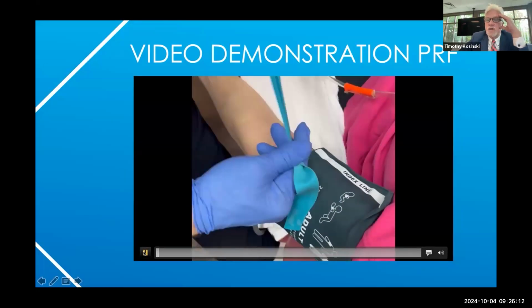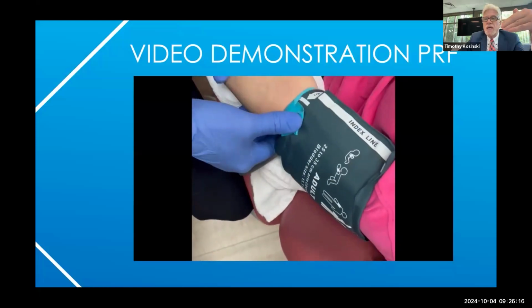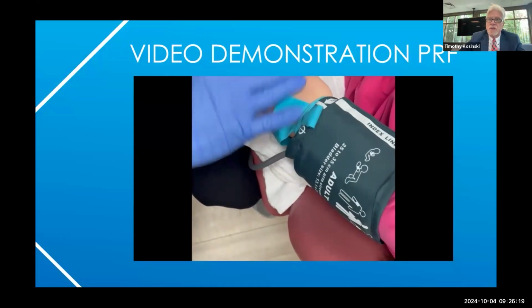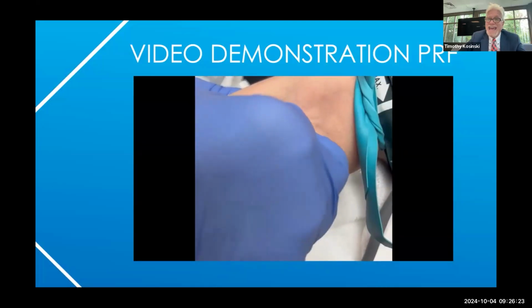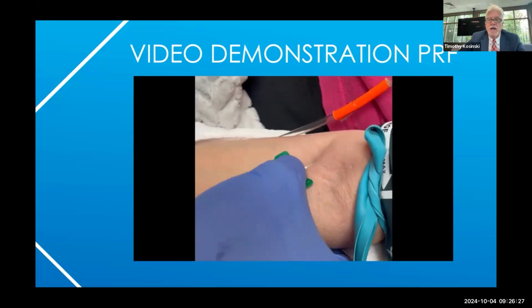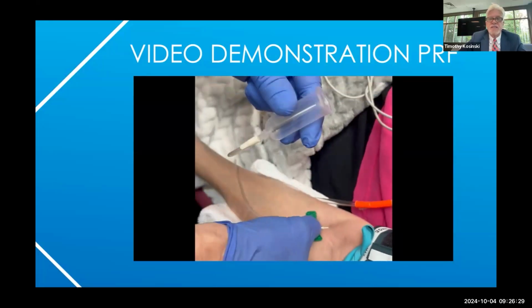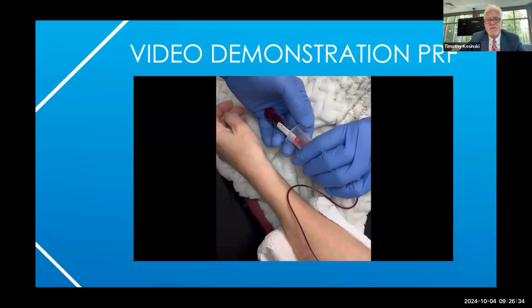So what we do is we tourniquet the patient and we will draw blood. Now you can have a staff member do this. Most community colleges will have phlebotomy classes. It's usually half a day or a day. There's nothing magical here, but we will draw blood in precise tubes. It's very, very quick. I work very fast in my office, as you can see.